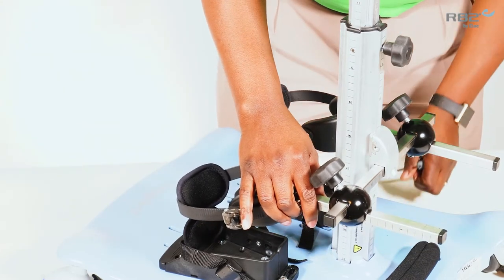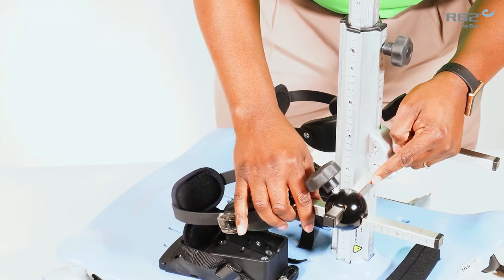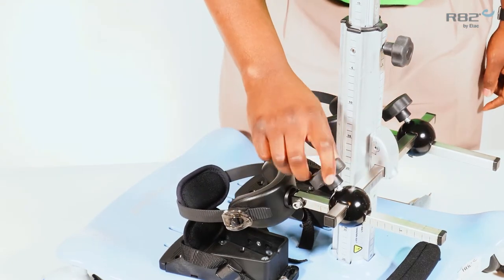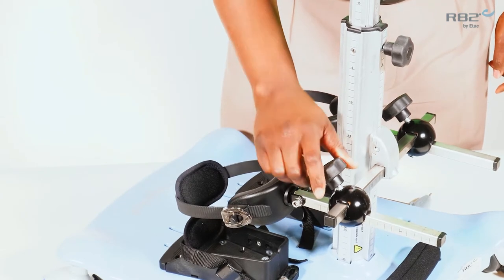You will notice markings on the rear of the knee support column. Once you reach your desired width, tighten the column.